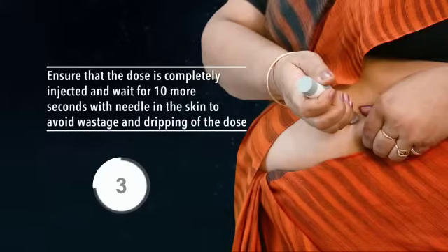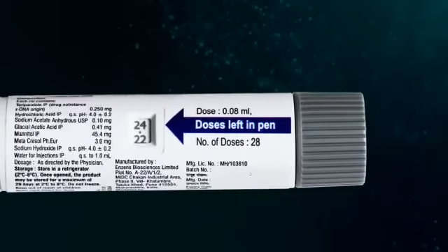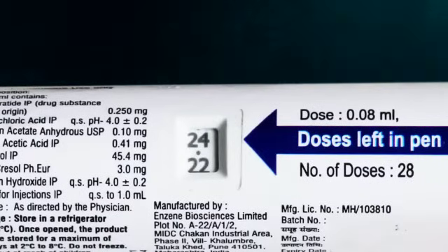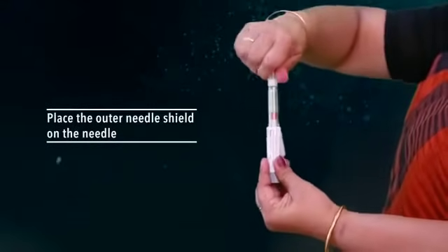wastage and dripping of the dose. Number six: when the injection is complete, you must see zero micrograms in the dose window, which confirms the full dose has been injected. Using the dose counting feature, after injection you can check how many doses have been left in your Osteri pre-filled pen. Place the outer needle shield on the needle.